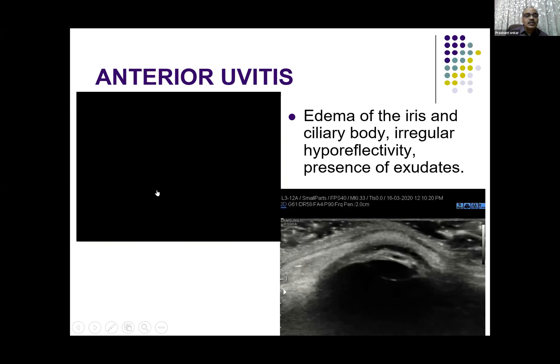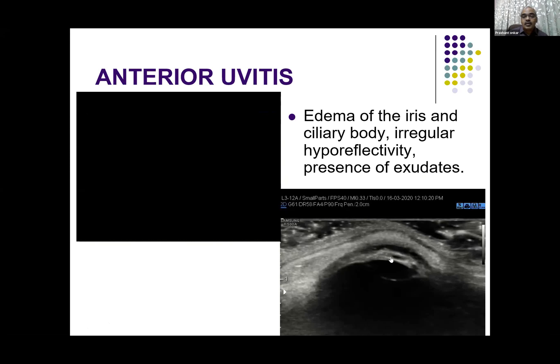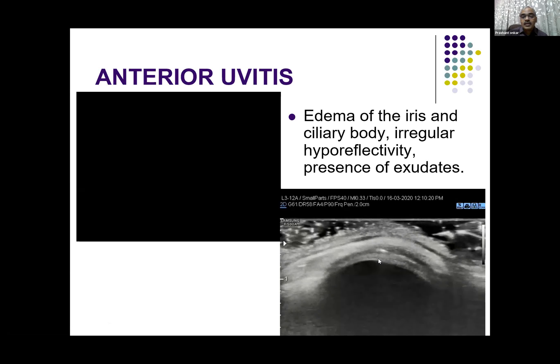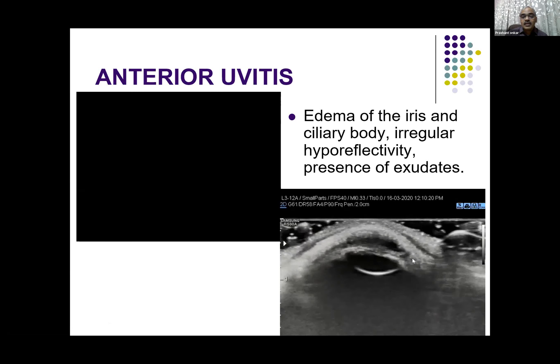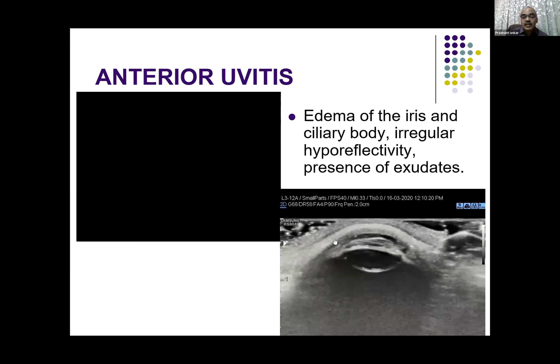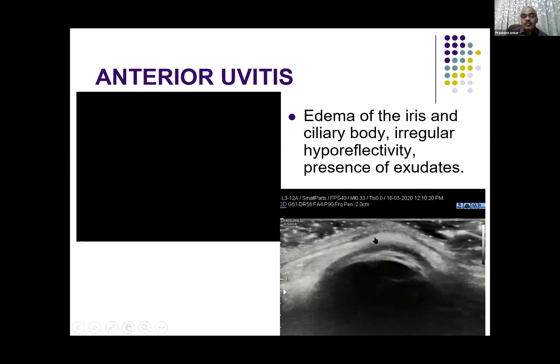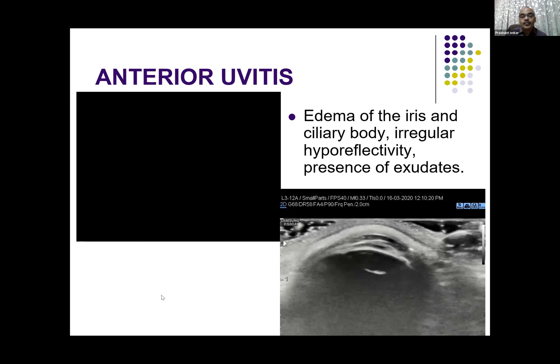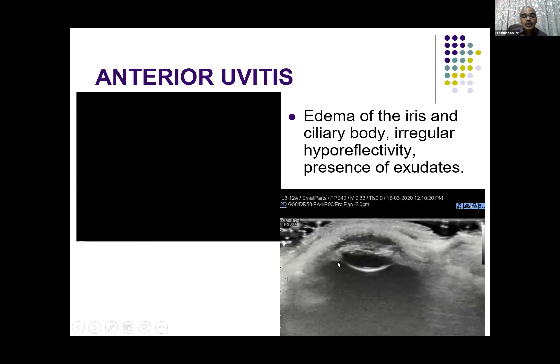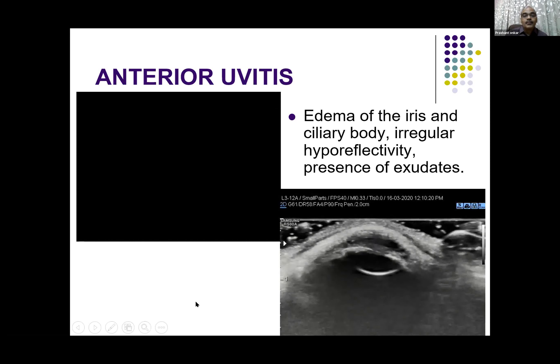This is a normal anterior chamber — you can see normal lens, normal cornea, iris, and ciliary body. Whereas in this example, you can see the iris and ciliary body, and exudates seen as dots in the anterior chamber. Why did this patient come? Because the cornea was opacified and the ophthalmologist could not see anything. We could give them information that the anterior chamber is severely diseased.